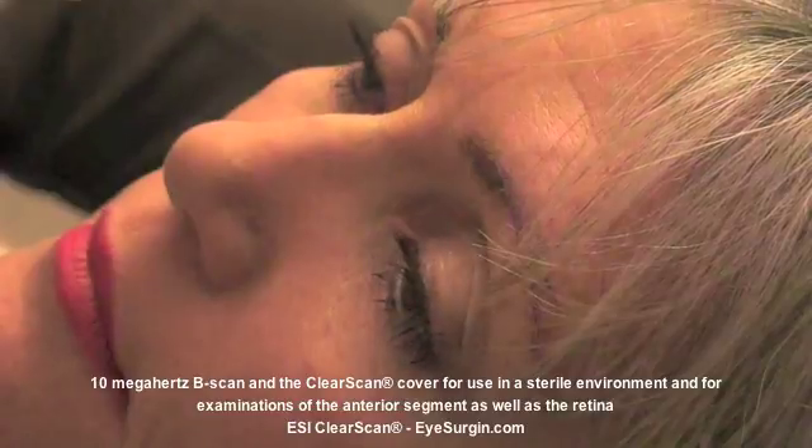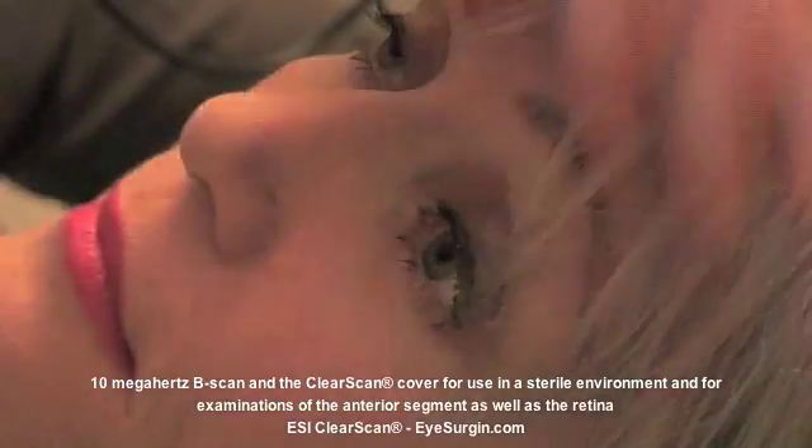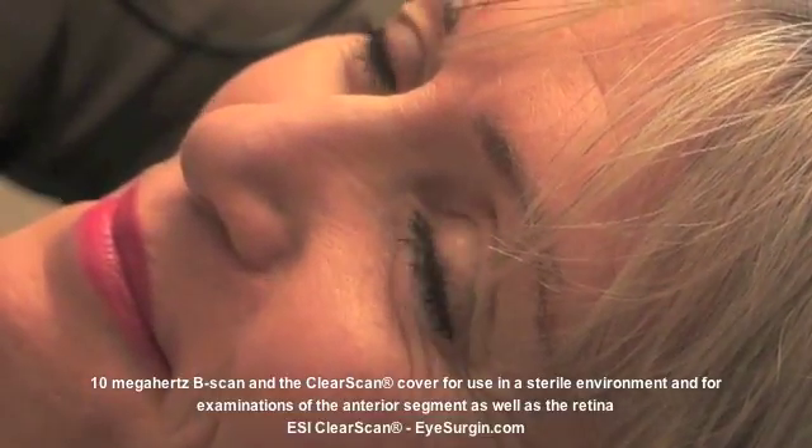With the bag filled and maintaining its conical bullet shape, after adjusting the collar up and down the adapter body and expelling air if necessary, we're going to scan the anterior segment.